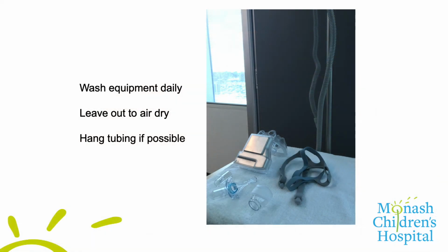Instructions for daily cleaning and care of equipment are on prompt. Equipment should be washed daily in soapy water and air dried. All equipment can be sterilised and reused if treatment is no longer required for this patient, so please keep all the equipment together for return to the Children's Sleep Centre.